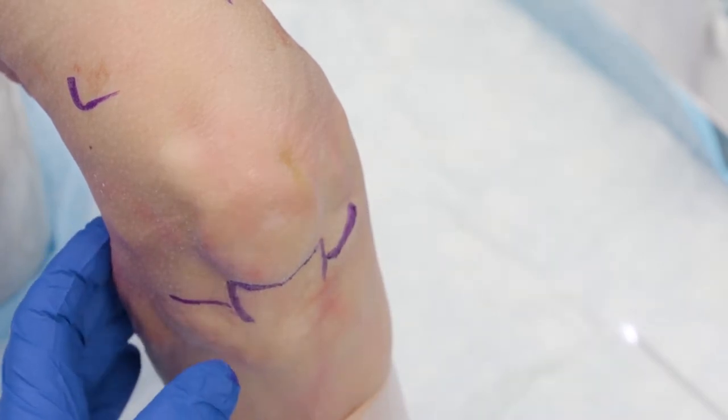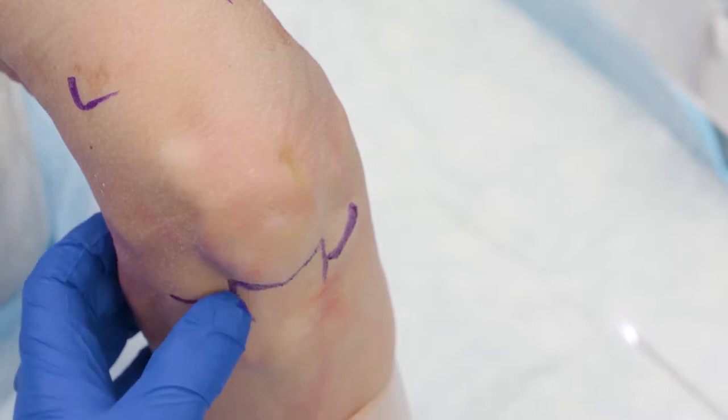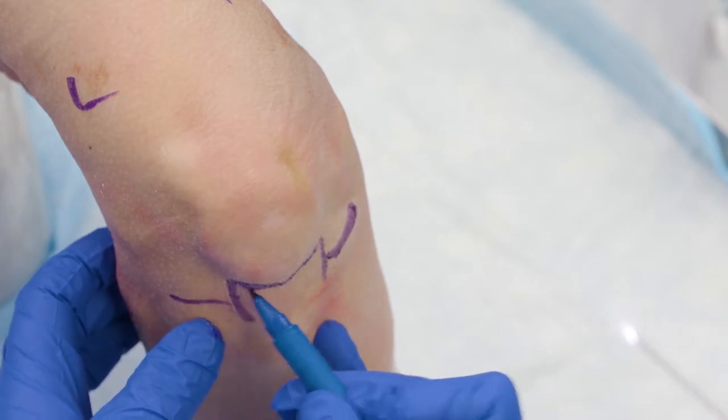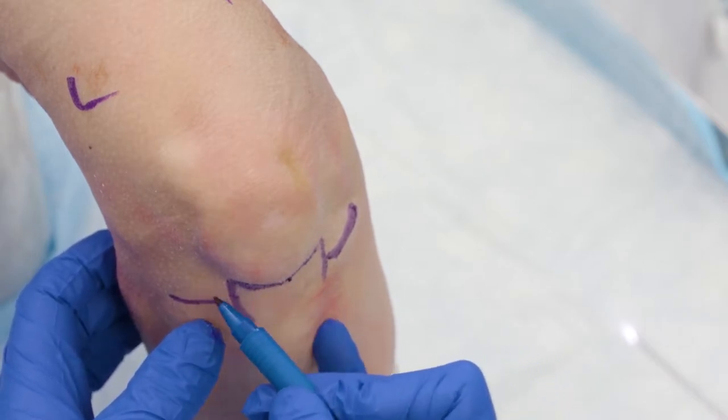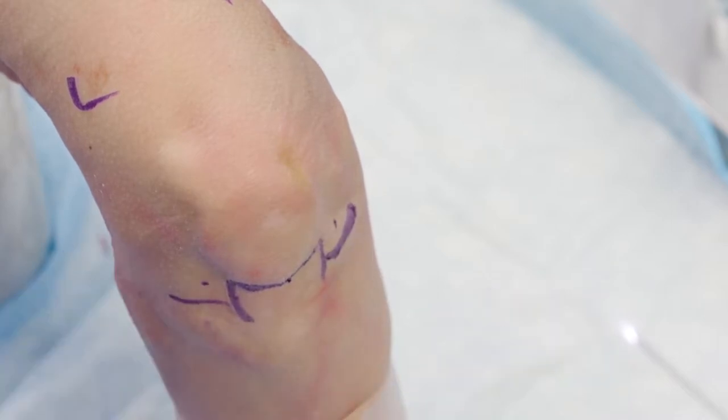Unlike surgical arthroscopy in the OR, this is a zero-degree scope. So I want to make sure that I'm reflective of this when I'm doing my needle arthroscope. I'll typically come in at the level of the inferior portion of the patella on either the medial or lateral side, about a half centimeter to a centimeter on either side of it. This will help me avoid the fat pad.